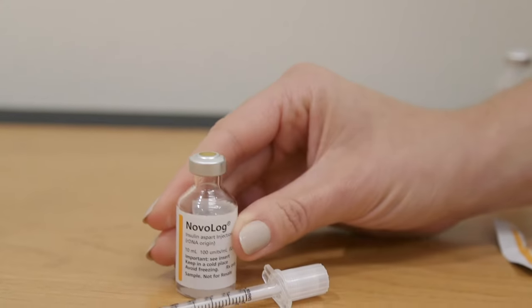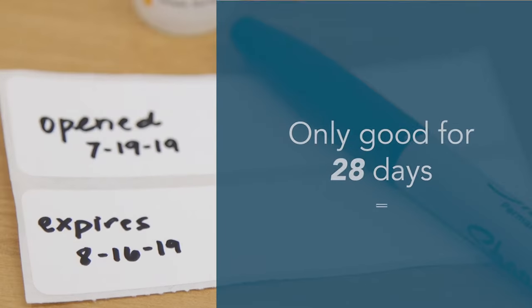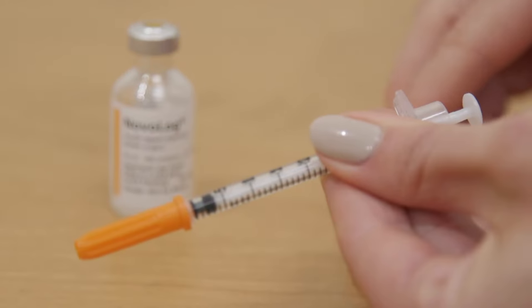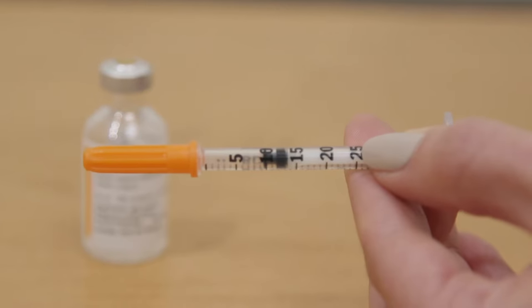You can throw away the cap after its first use. It's a good idea to write down the date on the vial of when you first opened it, as it is only good for 28 days. Take the white cap off the syringe. Draw the plunger on the syringe to the number of units you will be injecting — for this example, we are using 10 units.